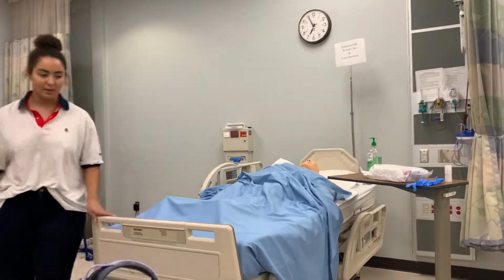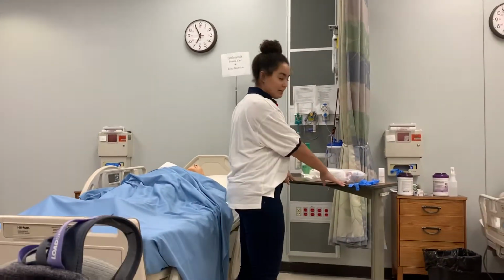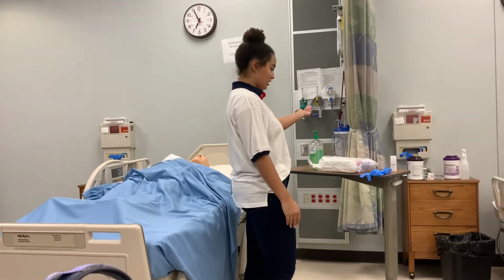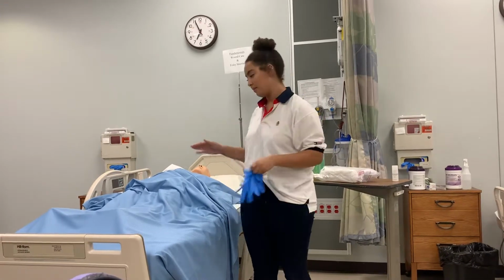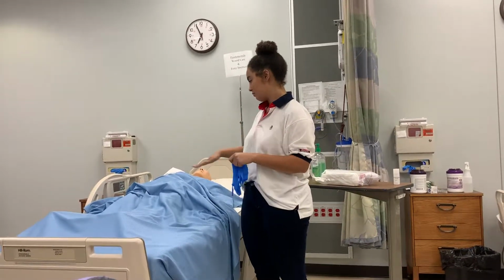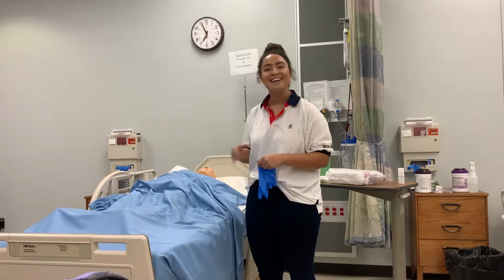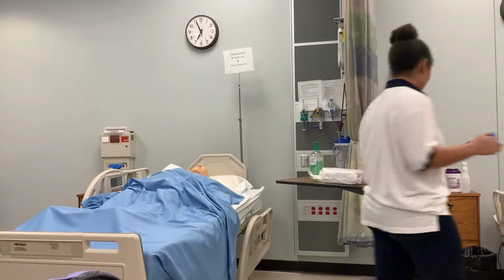All right, so I raised my bed to the appropriate height. I have a sanitized workstation with my sterile kit, my hand hygiene here, and this pair of gloves I'm going to provide pericare to his area with, which I will throw away.